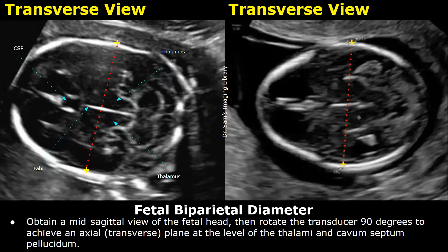BPD is one of the biometric parameters used to estimate the fetal weight and gestational age. First, you locate the fetal head and obtain a parasagittal view of the fetal head, then rotate the probe 90 degrees to scan in an axial or transverse plane.